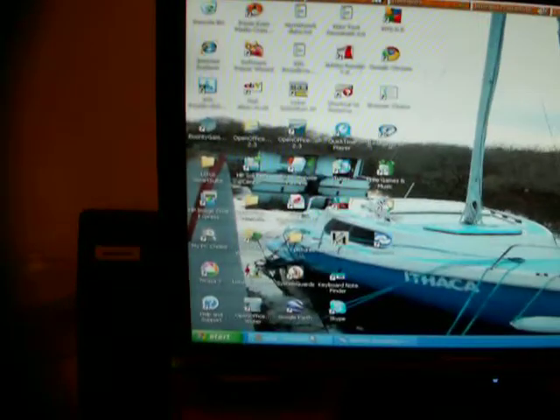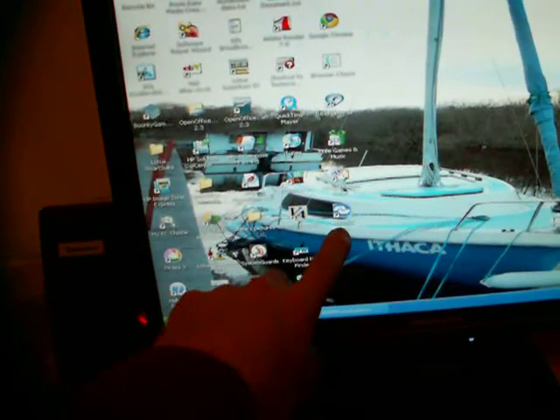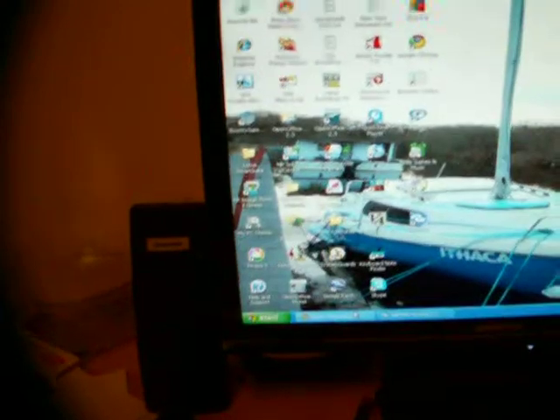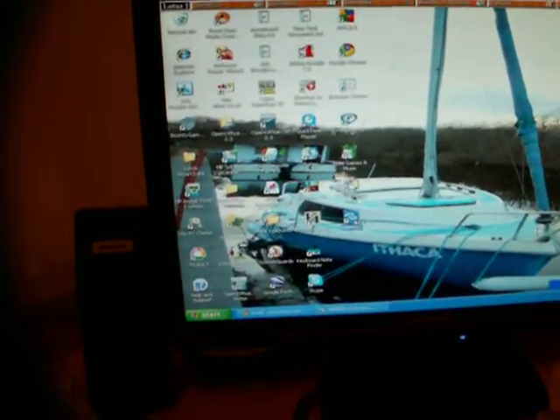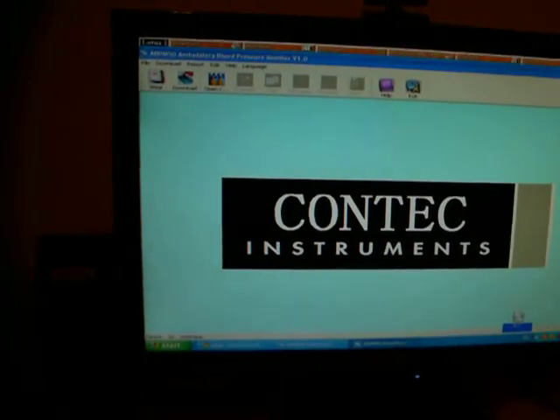This is my computer. Here you can see that the software has been installed — ABP-M50. I will open it up just to show you. There you can see. I will close it again.